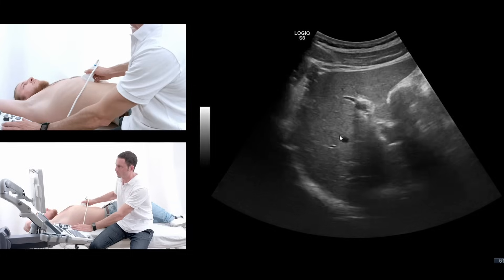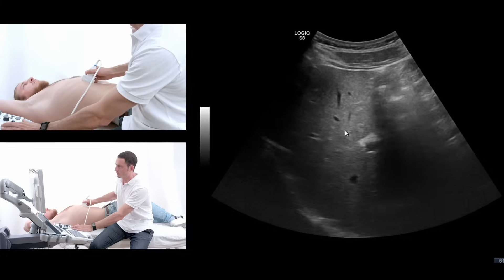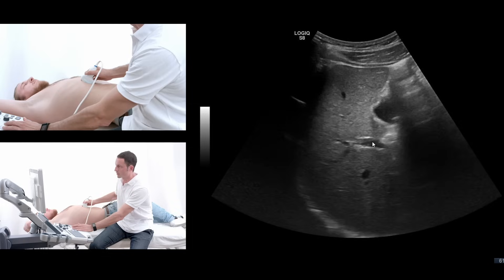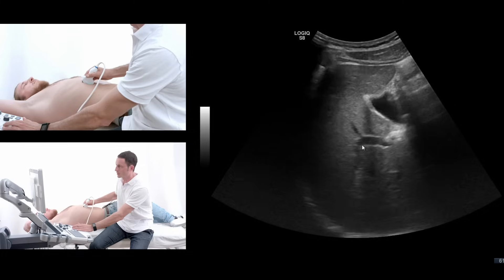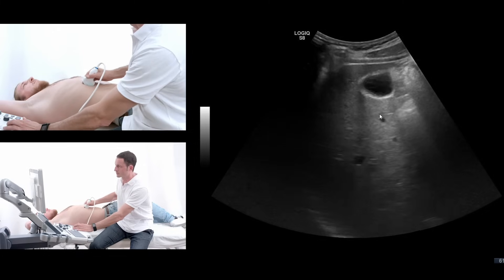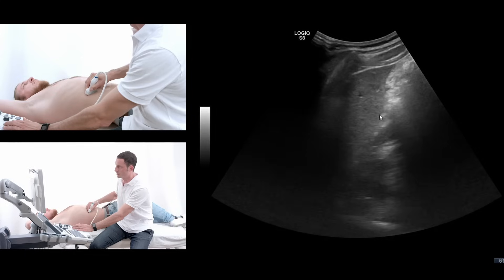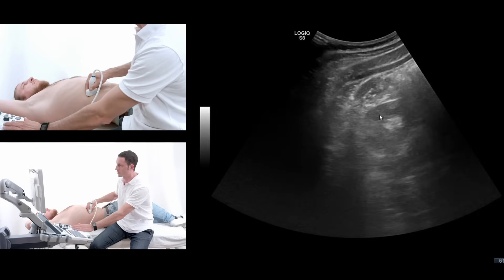When I move farther over, I come to the right liver lobe. You see the portal vein of the right liver, the right portal vein. And you see the gallbladder again. Now I move gradually down to the end of the liver. Here comes the right kidney.